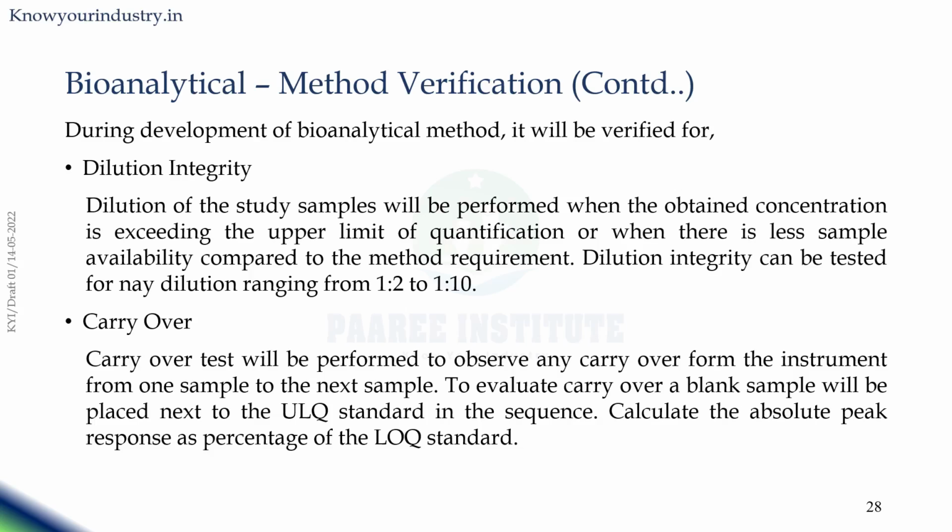Then comes the carryover. The carryover test will be performed to observe any carryover from the instrument from one sample to the next sample. So the injections are happening one after another.